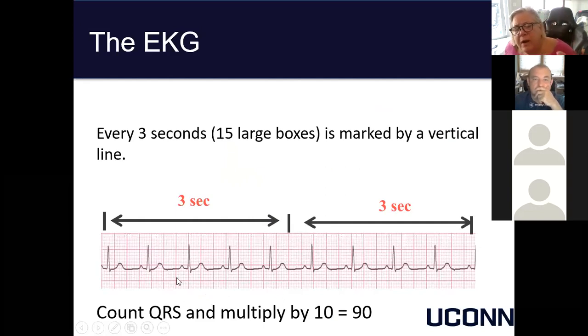With electronic calipers, or when you have calipers, you can usually make those measurements more easily. With electronic calipers, you move your measurement sticks, and it calculates the time itself. You don't even have to count it.